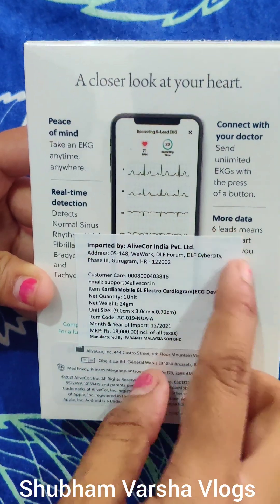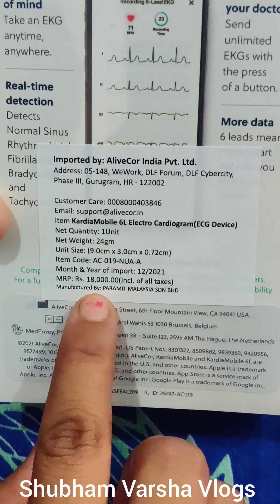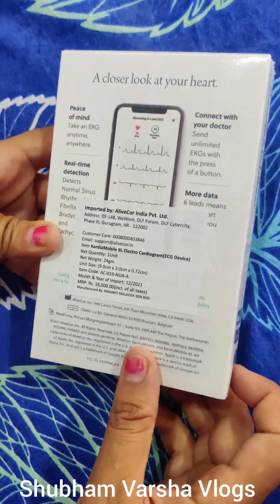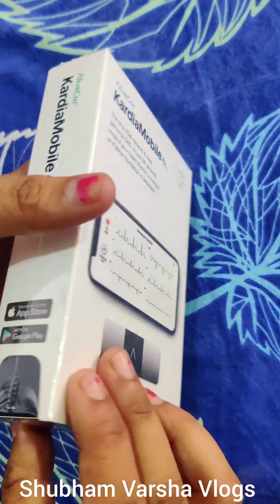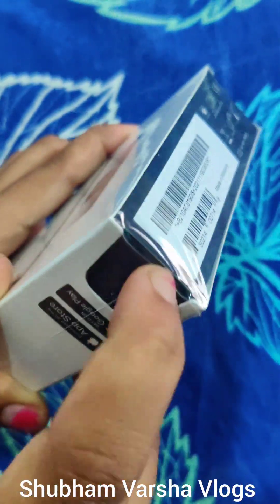It connects with your doctor. You can send your ECG report through WhatsApp and it is easily available in the market for Rs. 18,000. But if you contact a person who works with AlliCore, you can get it for Rs. 12,000.